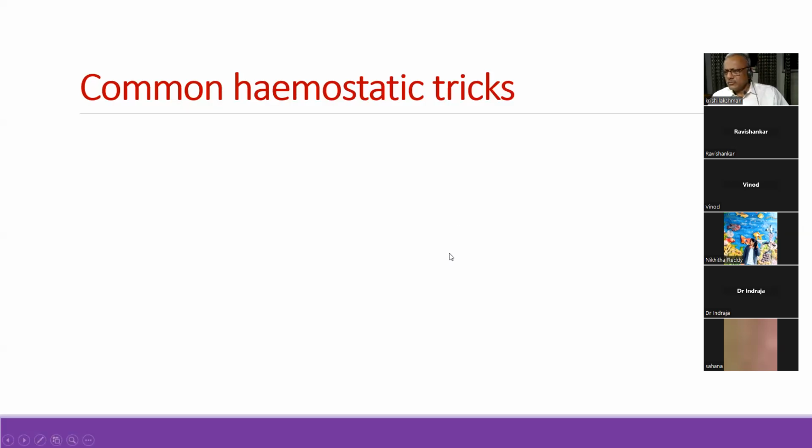You can use omentum, which may come up to that area. Yes, sir. If you have half removed the gallbladder and the gallbladder is still there, stop retracting away from the area, take that half released gallbladder, or any organ that can, and put it up there for pressure. Do not remove it and keep testing every half a minute whether the bleeding has stopped or not. Keep a sustained pressure for 3 to 5 minutes without disturbing that pressure.